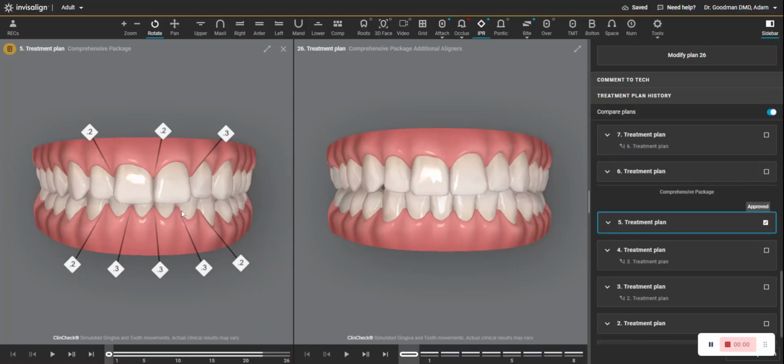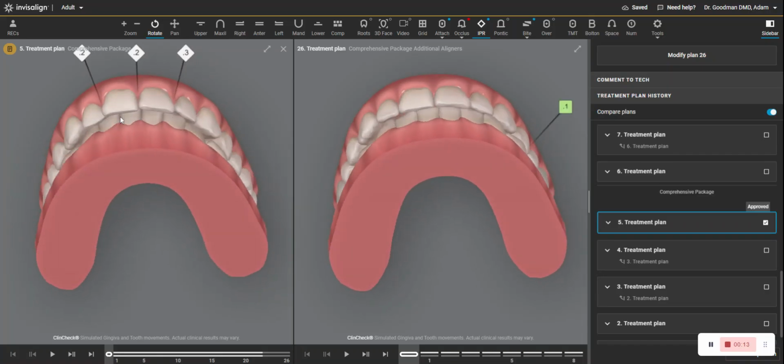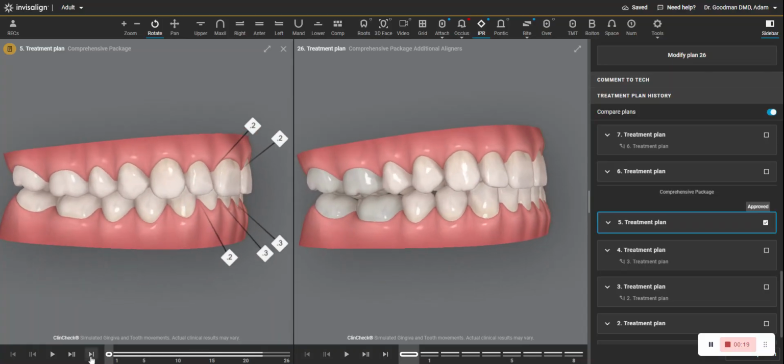I want to share an easy principle you can use in all your aligner cases. This patient transferred to me just a couple of weeks ago. The way the patient started with the prior orthodontist, it was a deep bite, and her only concern was the misalignment of the anterior. Well, this orthodontist chose to basically distal drive everything.